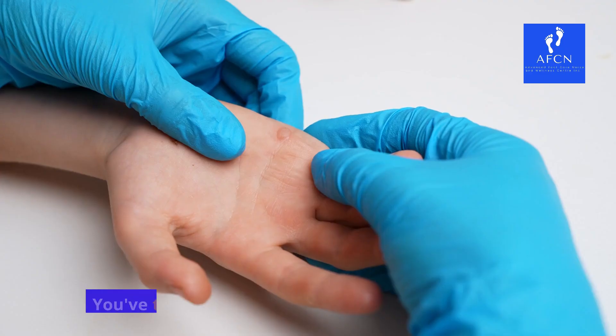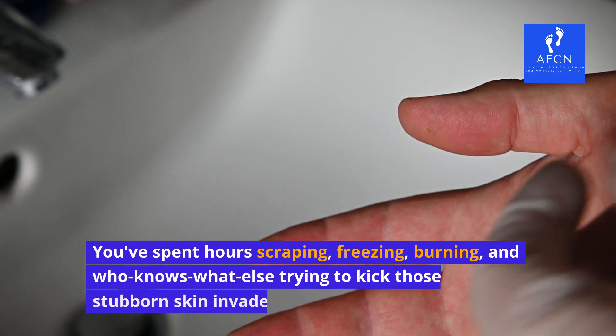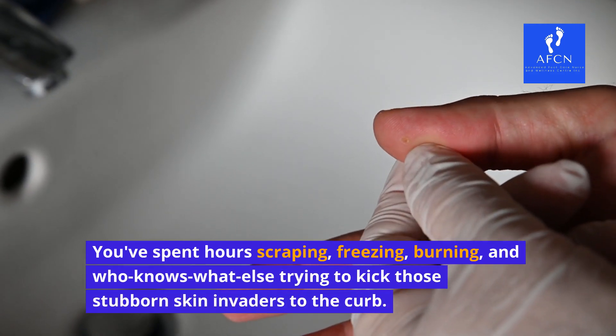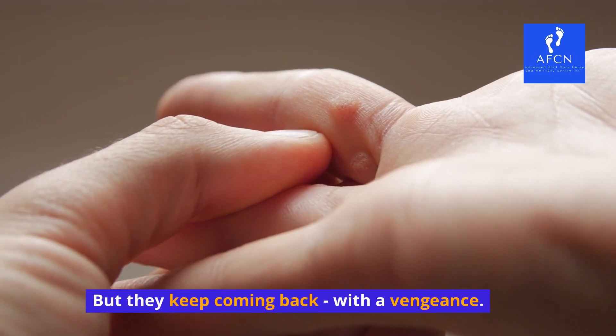What is Swift Microwave Therapy? You've tried every wart remover under the sun. You've spent hours scraping, freezing, burning, and who knows what else trying to kick those stubborn skin invaders to the curb. But they keep coming back with a vengeance.